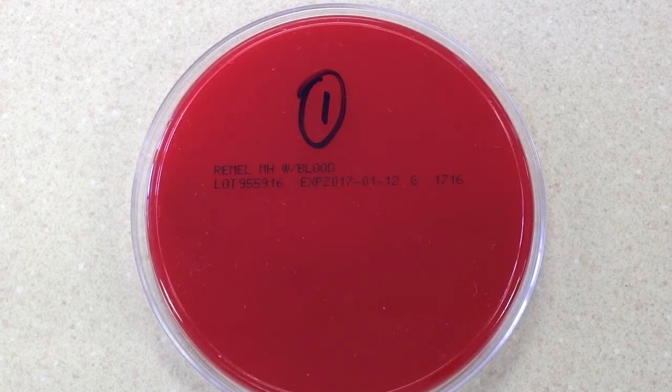On this particular culture, usually just one plate is set up. We are using just a 5% sheep blood plate, but there also exists a specific plate for group A strep. But we're just going to go ahead with our 5% here.